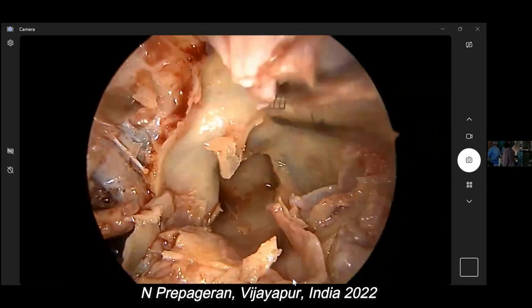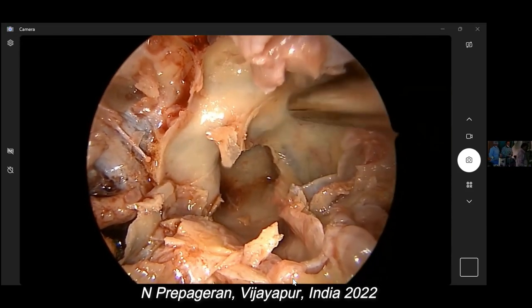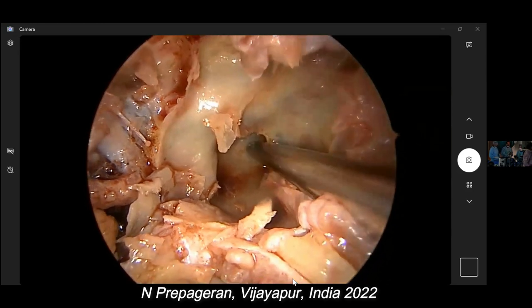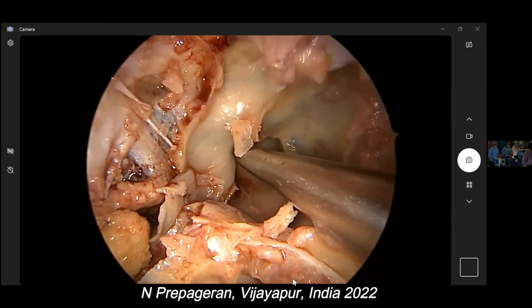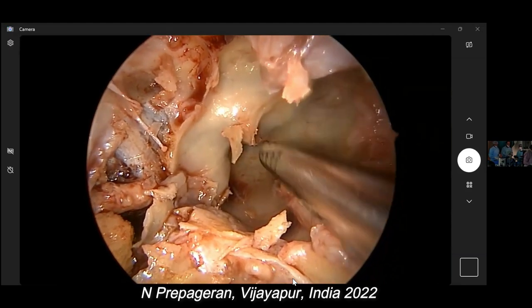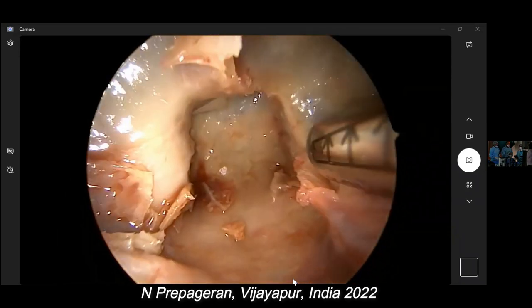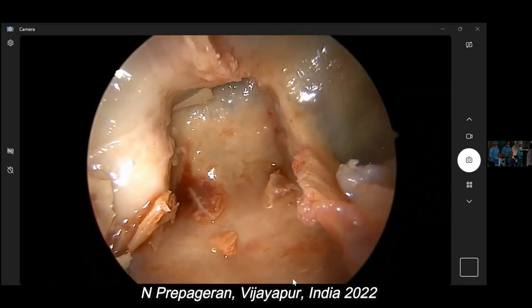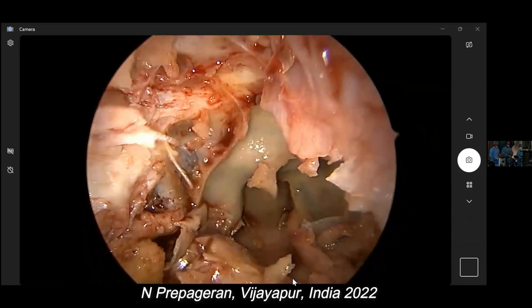Can you see? This is the bone I removed. This whole thing was an air cell from the ethmoid going backwards. This is sphenoid all the way. Look at this. So this is an air cell from the ethmoid going backwards. So see the OCR here.